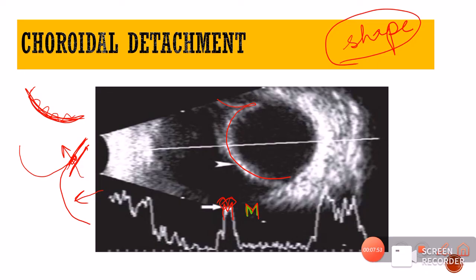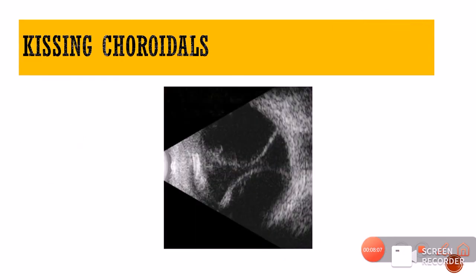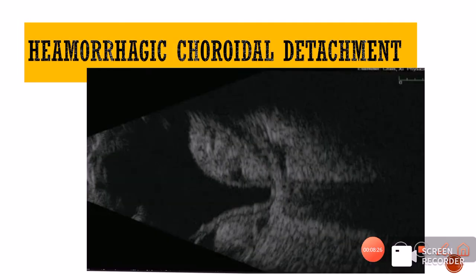In this choroidal detachment, we can see an echo-lucent zone — no echoes coming from the center of the choroidal detachment — meaning this is a serous choroidal detachment. This next case shows kissing choroidals: one choroidal detachment coming from one side and one from the other, both coming very close to each other — looking as if they are kissing — hence the name kissing choroidals.